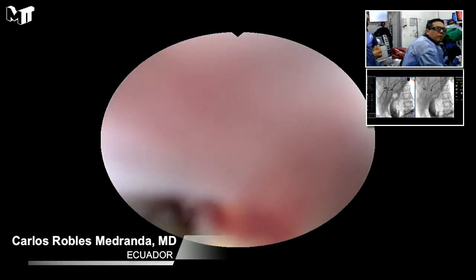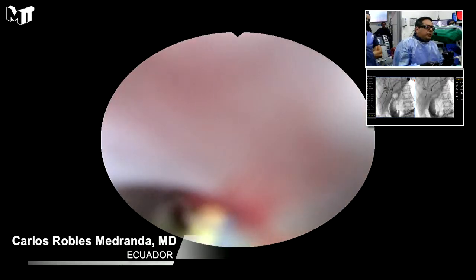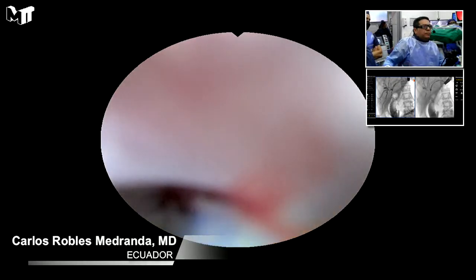Because I don't see like real anastomosis here. I believe this is, we have the chance, you see?